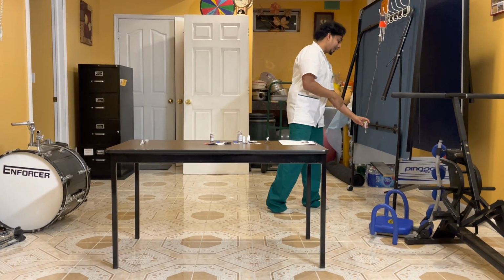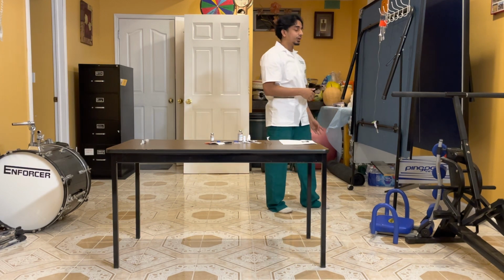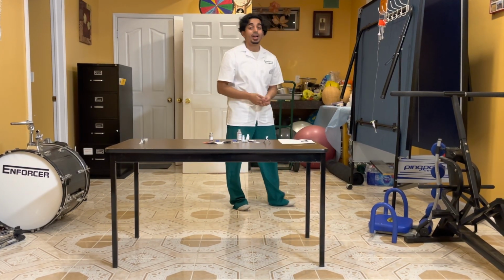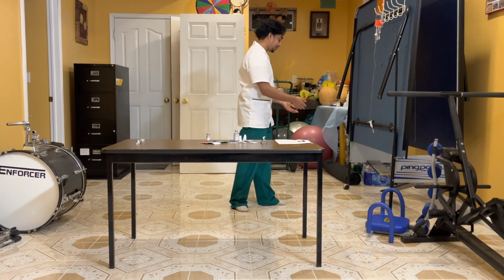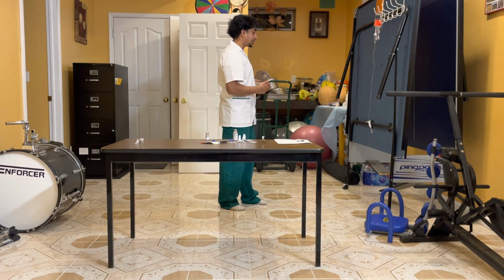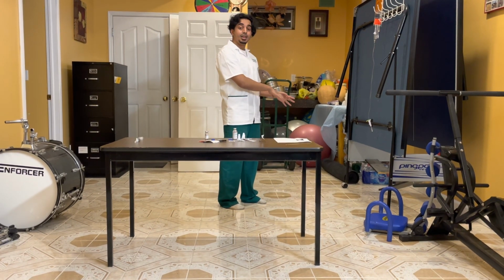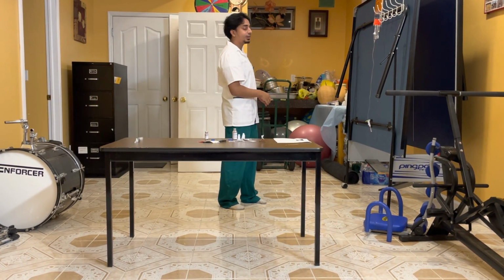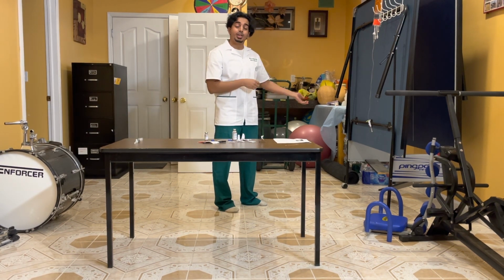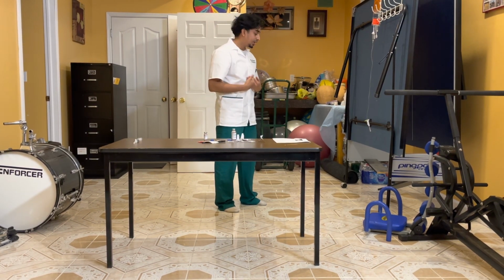Now that I have the rate in, I also make sure I let the patient know what I'm going to be doing. I assess the patient. I let the patient know to tell me if there's any concerns, any issues. I assess the IV line. Everything looks perfectly fine. No abnormal findings. Patient showing no issues. I show her the call bell, so if she has any issues, she can let me know.